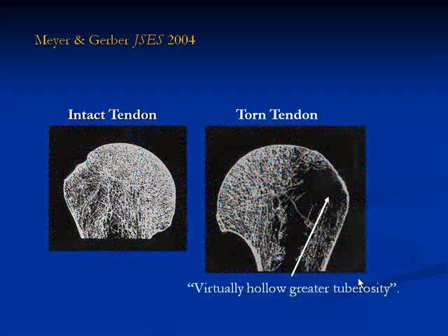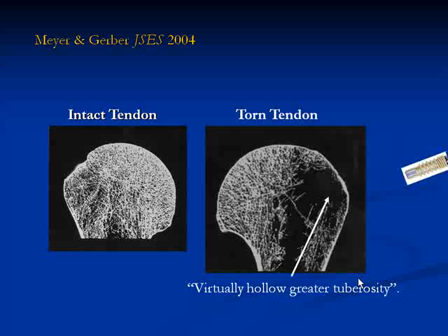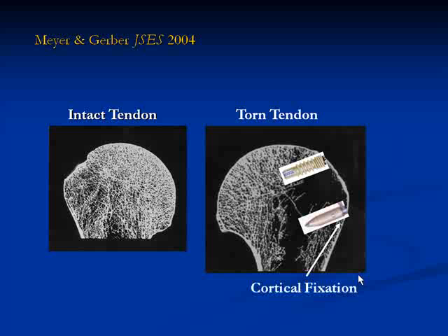And one of the reasons, the rationale for this treatment, particularly with very chronic tears, is that there can be a very profound osteopenia in the greater tuberosity, which can create a great challenge for our fixation. By spanning like this, we can put the threaded anchor right along the articular margin in the dense subchondral bone, and then use the VersaLock anchor in a very far lateral position to take advantage of its cortical fixation, where there's oftentimes just a thin cortical shell, and we can span right across that deficient portion of bone, which helps make this a relatively strong type of fixation.